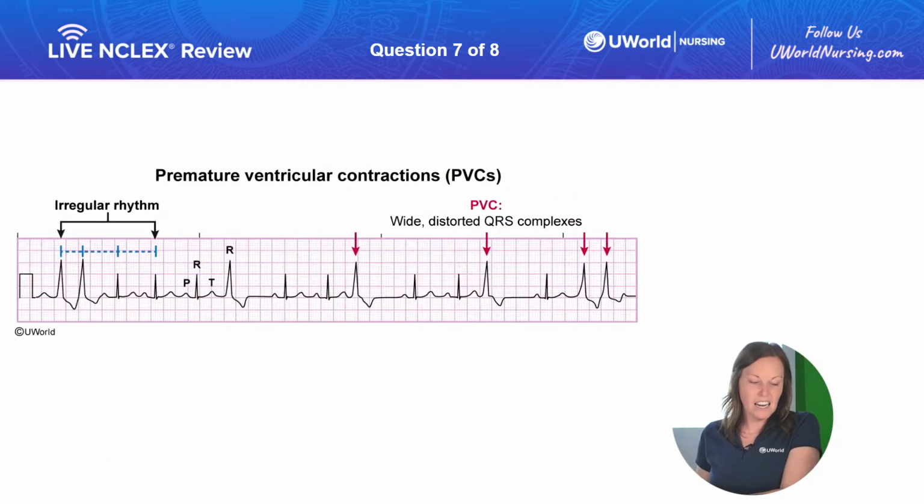All right, you guys got it. Our correct answer on this one is PVCs, so that was option 4. When we see PVCs, one PVC is okay. Anytime we mess with the heart, if we do any type of procedure or agitate the heart in any way, we would expect to see a PVC. But when we have multiple PVCs, we worry about that progression to VTAC. We know VTAC can lead to VFib. VFib we know is a lethal dysrhythmia that we need to defibrillate.